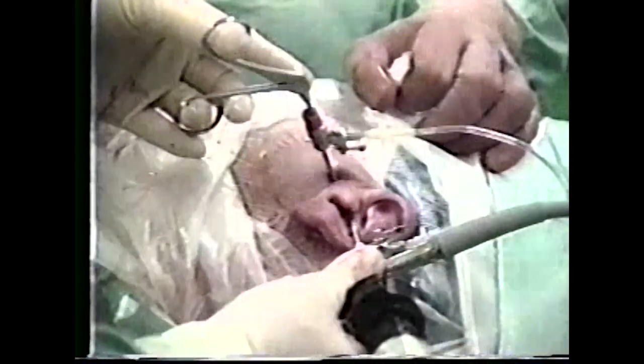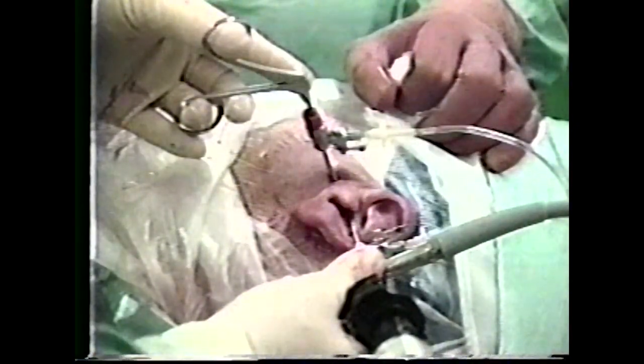To solve this visualization and access problem, a third entry portal is described, which provides for clear visualization and uncluttered instrumentation for the medial and especially the lateral TM joint spaces. This portal is the Endaural portal. The subject of this videotape will be to demonstrate the placement and working advantages of this approach.